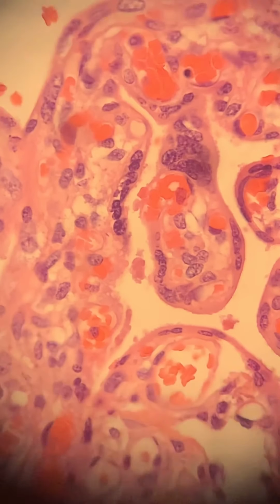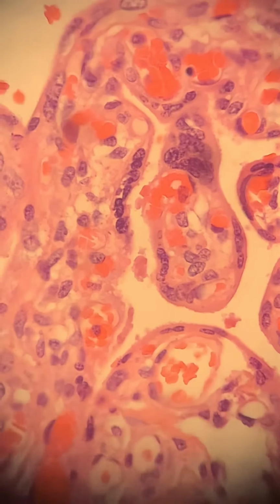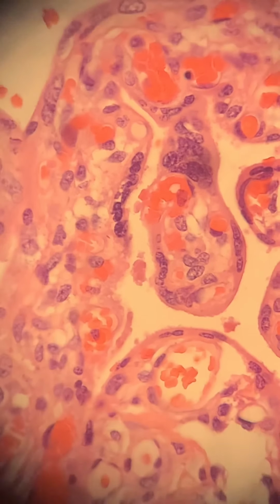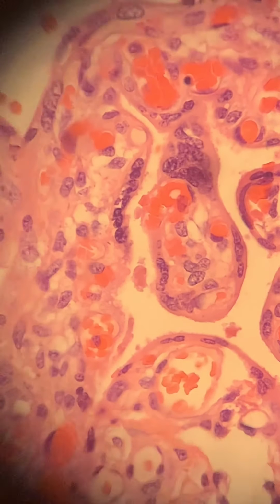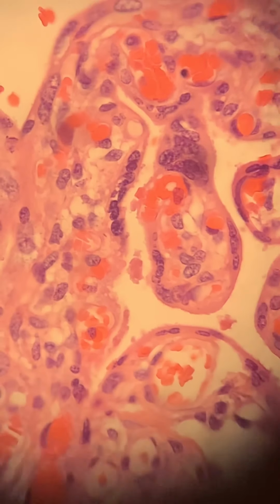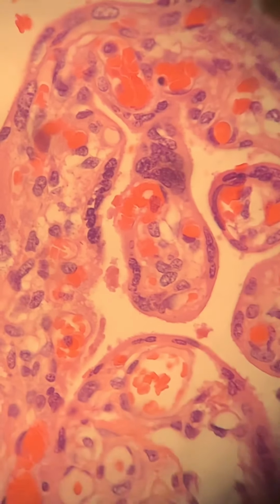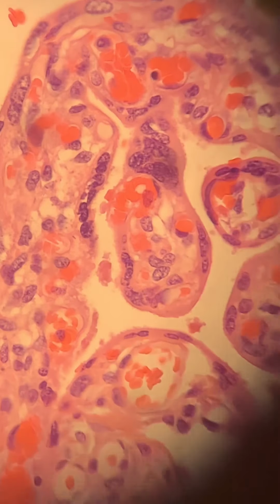So whatever happened to this baby happened pretty acutely, in terms of that ascending infection. You see the villus edema and the slight fibrosis. You see that with intrauterine distress and demise. But there is no significant villitis. You don't see any inflammation in the villus. So this was a rather acute event, perhaps surrounding the C-section procedure. Thank you.